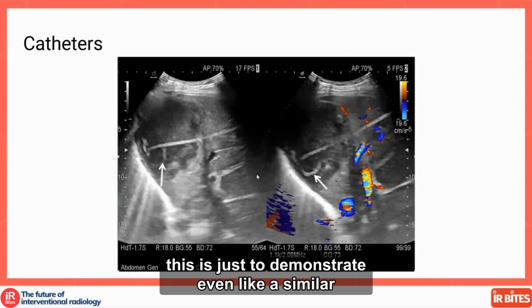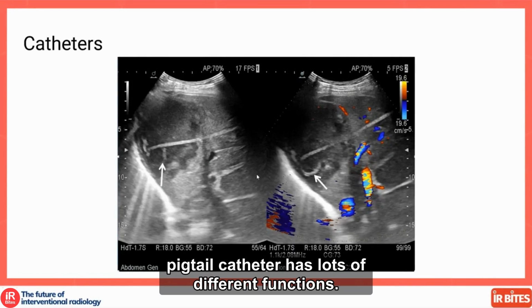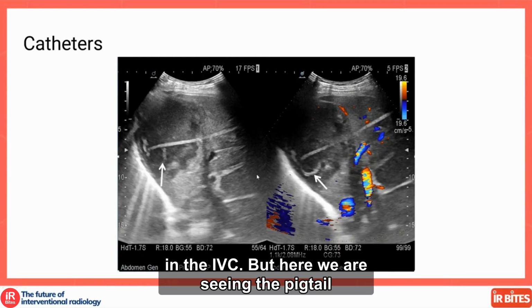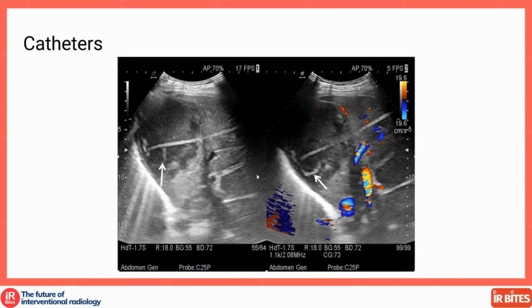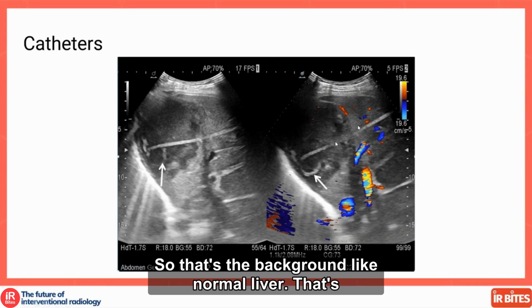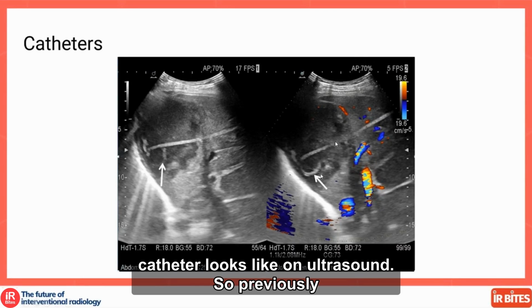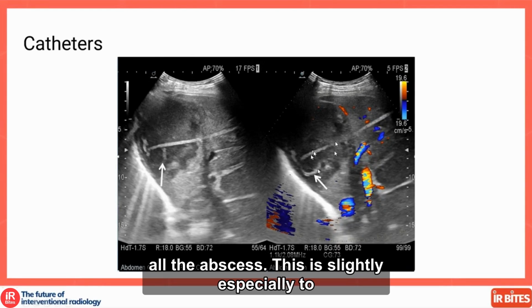And this is just to demonstrate that even a similar pigtail catheter has lots of different functions. Previously we saw a pigtail catheter being used in the IVC, but here we are seeing the pigtail catheter being used to drain a liver abscess. That's the background normal liver. That's the big abscess there. And this is what the pigtail catheter looks like on ultrasound. So all the side holes here would be draining the abscess.